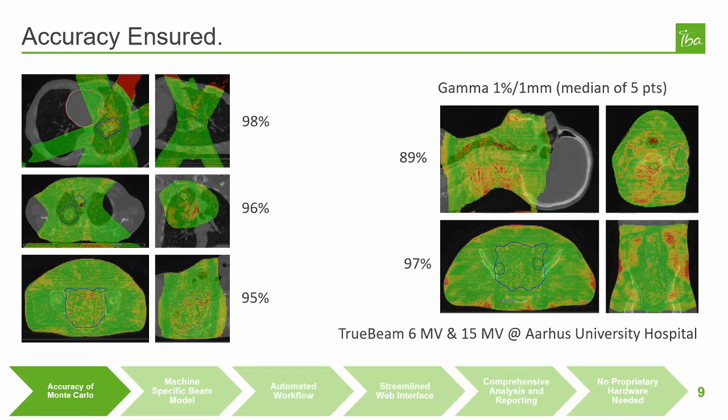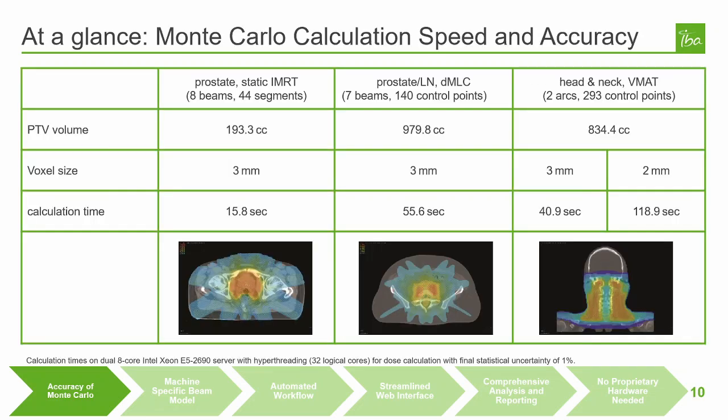In particular, the accuracy of SciMoCa for non-homogeneous regions is notable, as this is where substandard algorithms typically face the most issues. SciMoCa users can trust the secondary dose calculation and save time investigating false failing cases observed by less accurate patient QA methods. But the accuracy of Monte Carlo has historically been associated with a trade-off for speed.